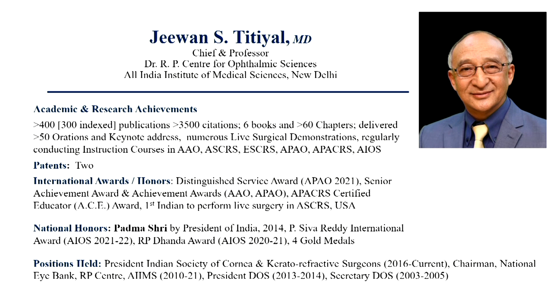While he's setting up things, I just wanted to mention one thing about the injection of IOL, which we saw Dr. JK showing, and this cartridge getting split up. So we get into a soup when you are doing a hydro implantation in such situations. If it is viscoelastic, it is fine. But if your one hand is not free with hydro inside, and then you get a split or the haptic gets stuck there, then you're stuck.